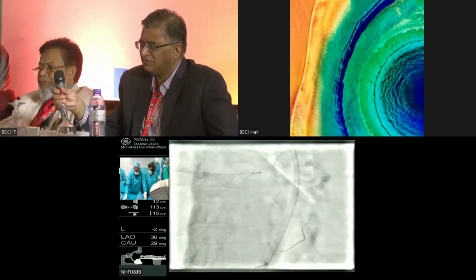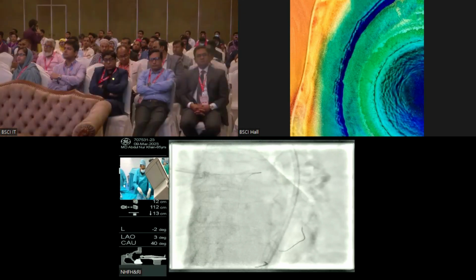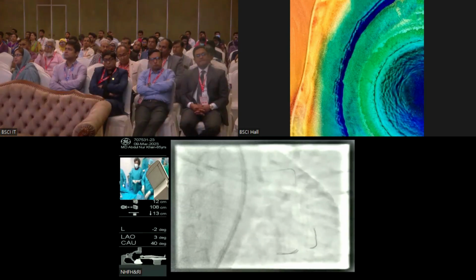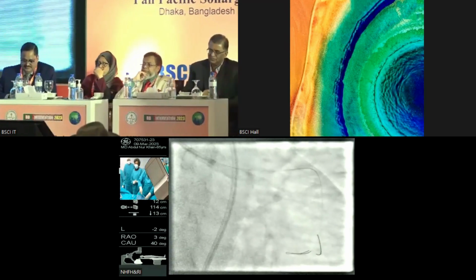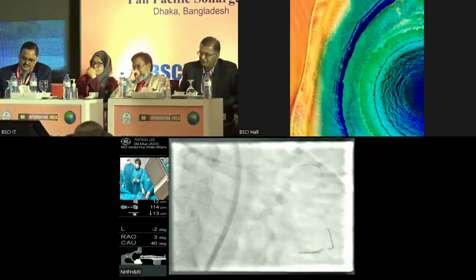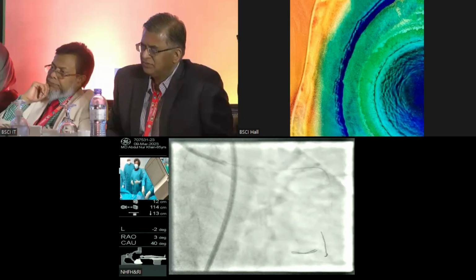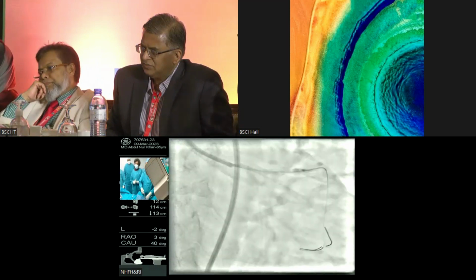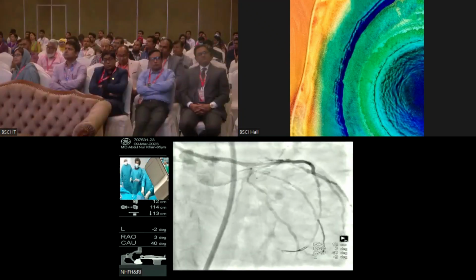We wanted to show our junior colleagues who are starting their career that yes, IVUS will indeed help. And what we saw corresponded to our findings in the IVUS, that indeed this calcium was significant and it was creating a 270 degrees of horseshoe-shaped calcium. Here one interesting fact was that we had superficial as well as deep calcium, but there were significant calcific nodules as well. And as you're aware, with nodules, it works better if you take a rota.